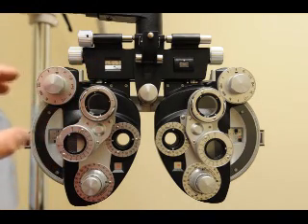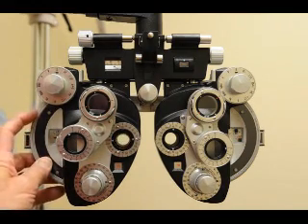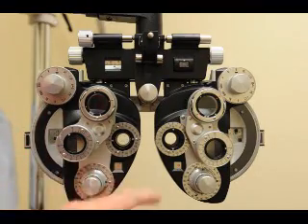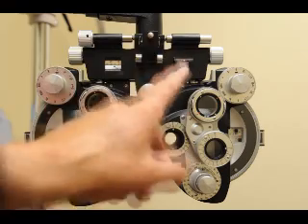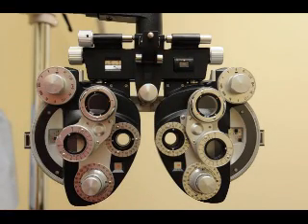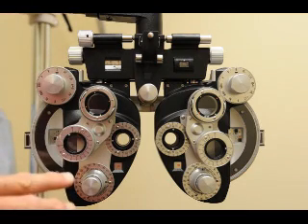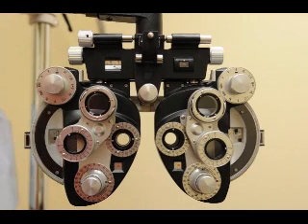Now you enter the autorefractor results. For example, if the autorefraction says this patient is minus one, minus one axis 180, and the other eye is plano — the patient is in position and the autorefraction is dialed in. Now make sure the patient can see the screen at the end of the room.